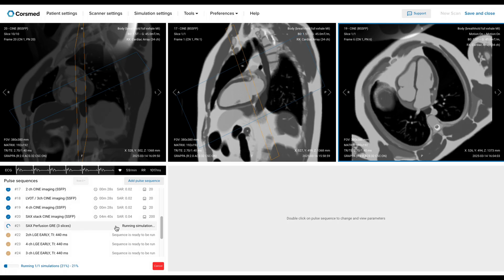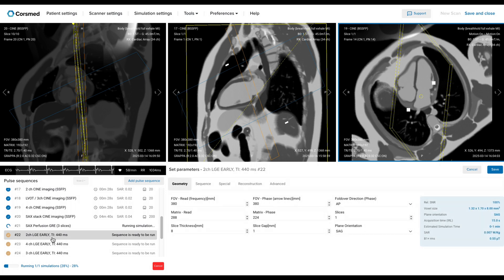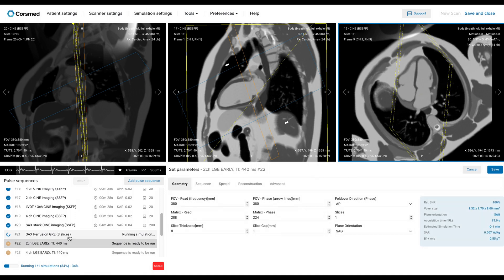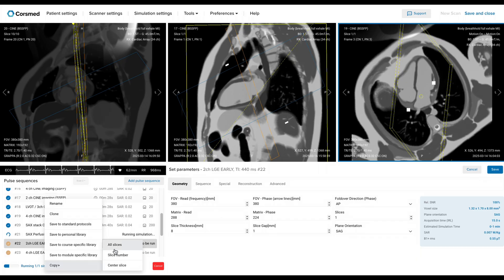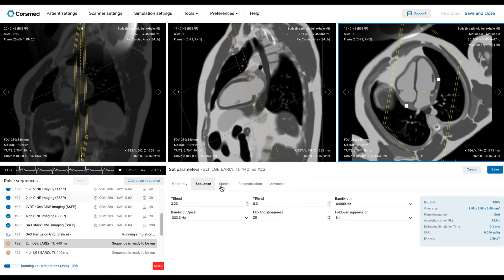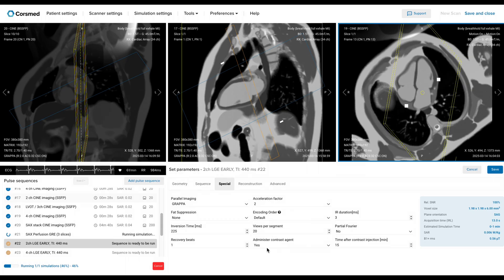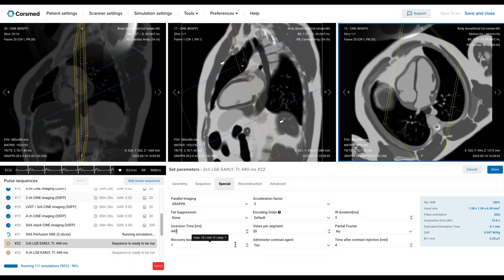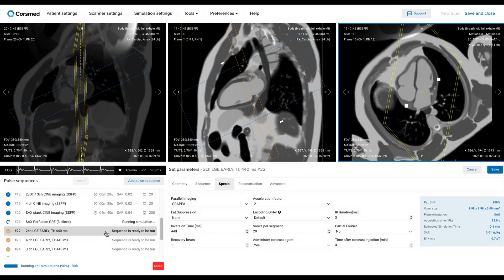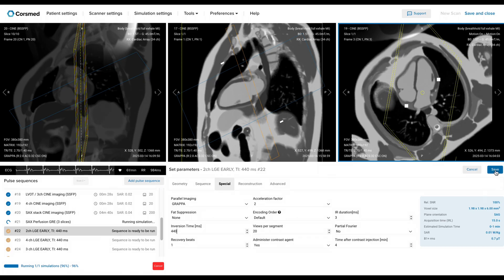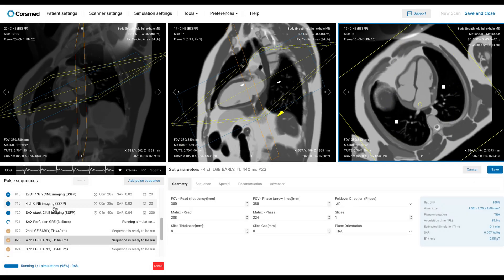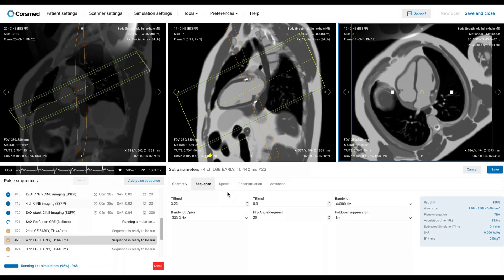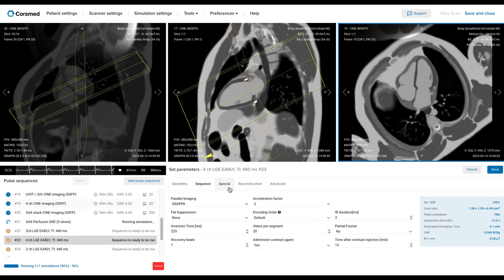Now let's move on to our early enhancement sequences. For the two-chamber view, I'll go ahead and copy all slices from my previous Cine two-chamber that we ran in part one of this video. I'll make sure these sequences simulate early gadolinium. Early gadolinium appears 3 or 4 minutes after contrast injection. It also needs a very high TI — like 440 — to show microvascular obstructions. I'll repeat the same process for the four-chamber. It's very important to copy the image position from what you've done before, so we can compare the images using the same slice planning.